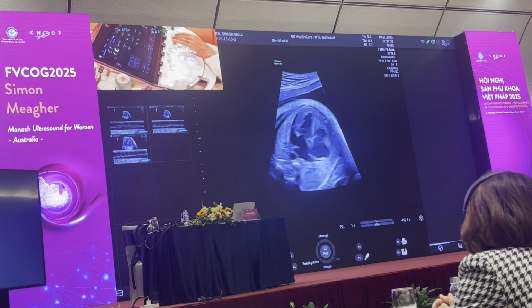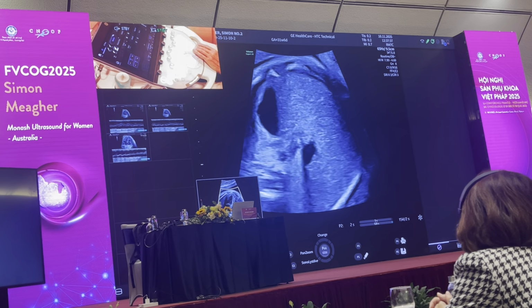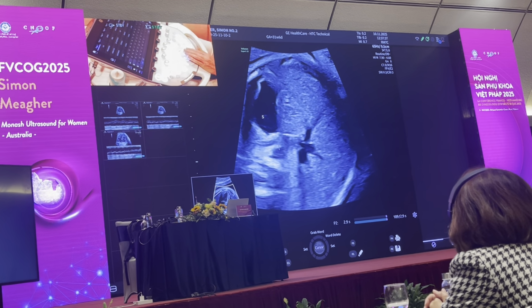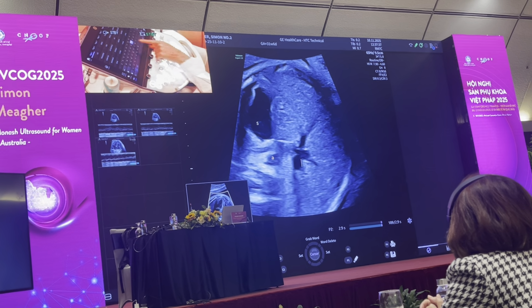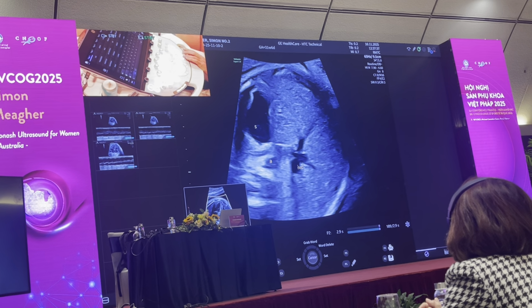But let's start with the anatomy of the heart. And first of all, go to the ISUOG guidelines. So here I have the stomach, section 1. I have the aorta to the left of the spine. I have the IVC, which is anterior to the right of the spine. And I save that image to file.